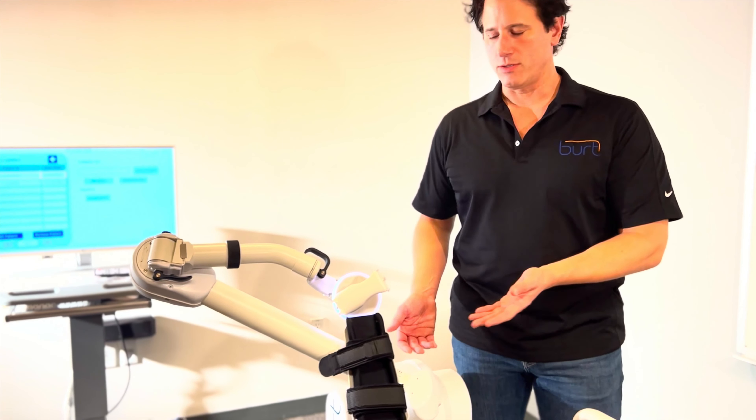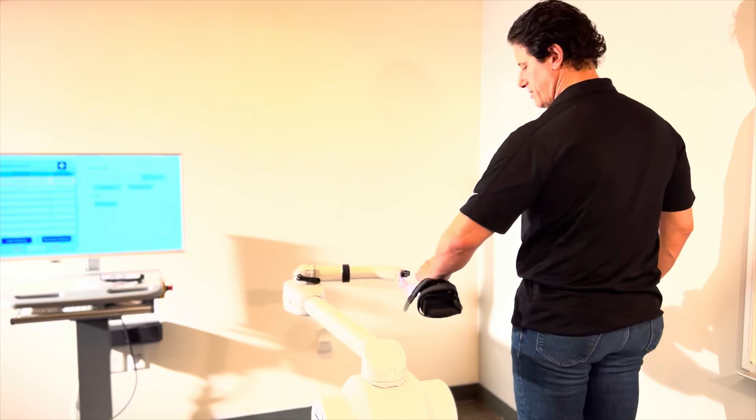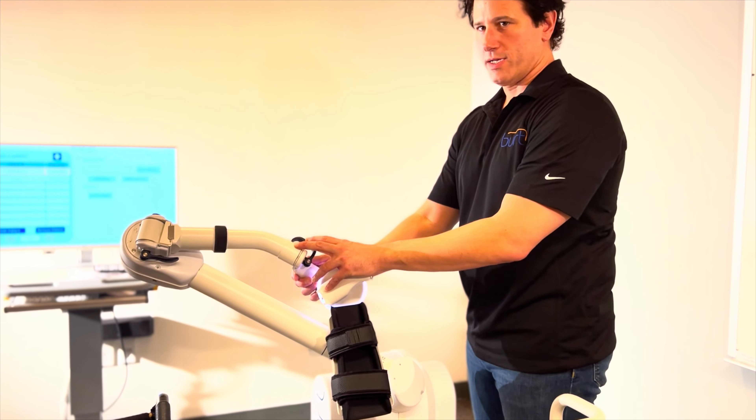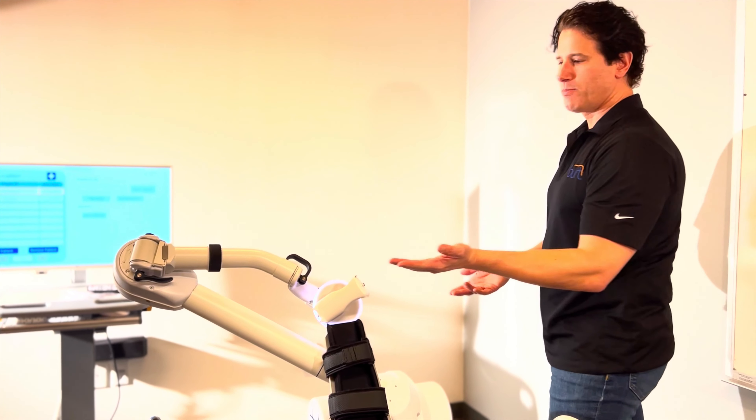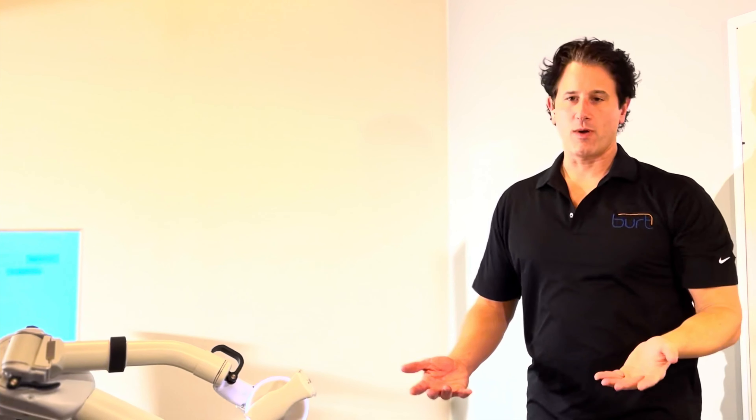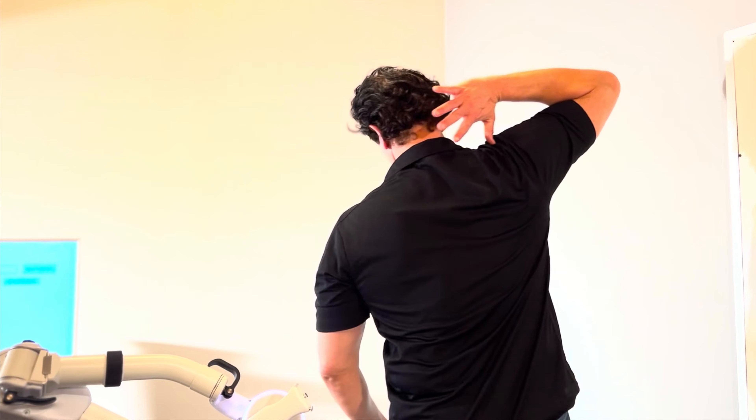Right now, it's set up for a left-handed person. The way I like to show this is, if you think of this as the shoulder, this is the elbow, and this is the wrist. When it's set up for a left-handed person, it should look like this. If we want to have it set up for a right-handed person, it should look like this.